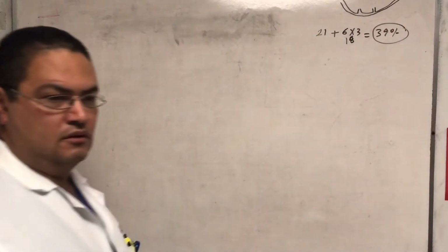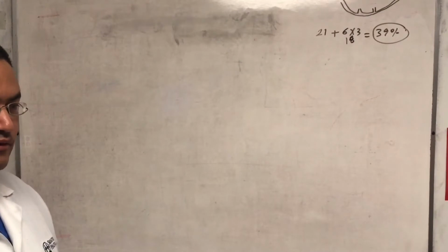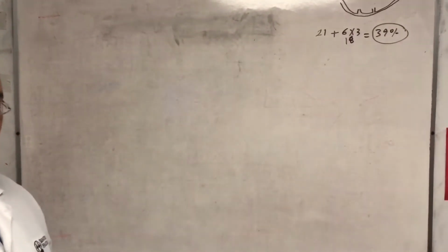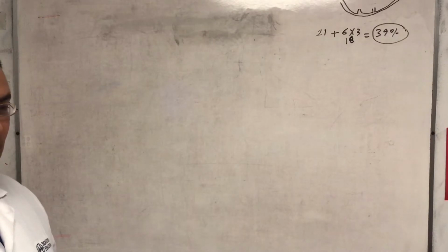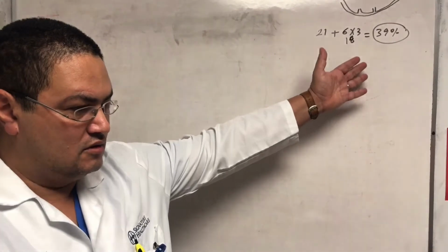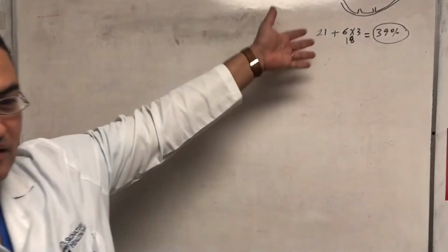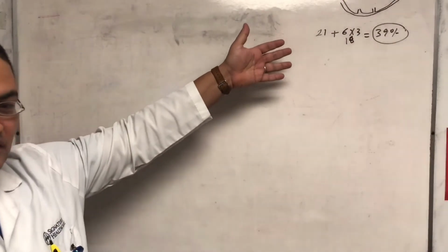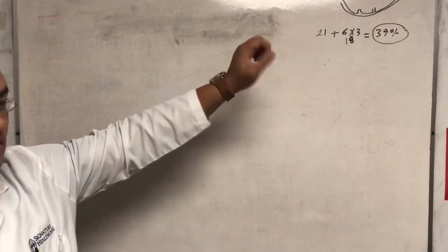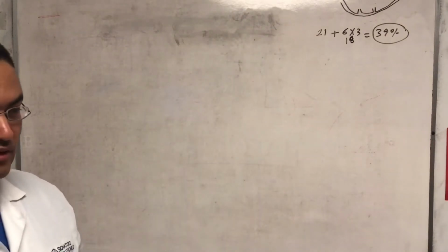About. So if you're wondering why everybody has their vents set up at 40%, not here, but in general, the most common FiO2 on the vent to start is usually 40%. That's because of this. It's an old myth. It was good when this is the only thing we had, because you can only go to 6 liters per minute, and that gives you about 40%. So that's why I set the vent at 40%, to know that the patient will tolerate being extubated when it's ready to be extubated.